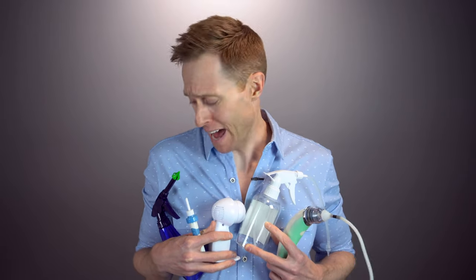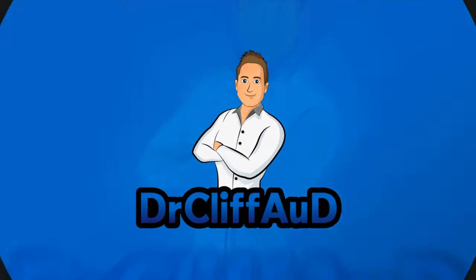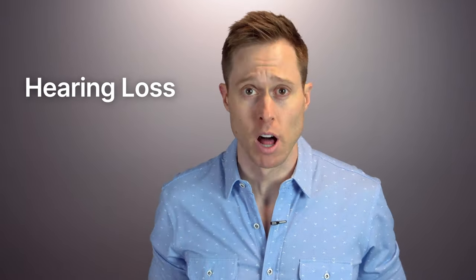Which one of these gizmos is best for at-home earwax removal? Let's find out! Excessive earwax buildup is a huge problem for a lot of people. While some earwax is actually a good thing, having too much earwax can lead to a lot of bad things, including itchy ears, pain, and even hearing loss.